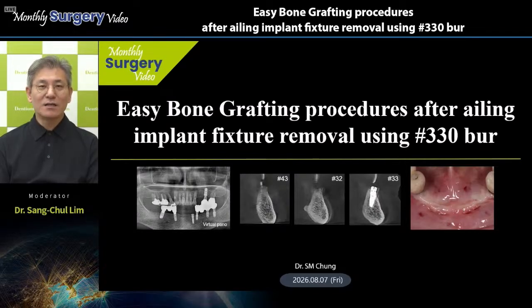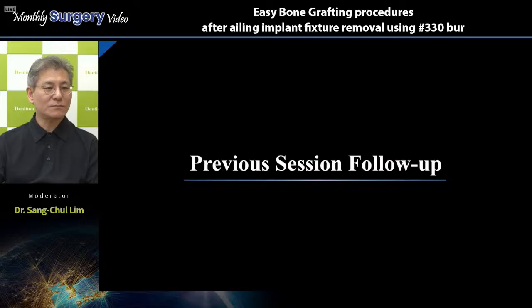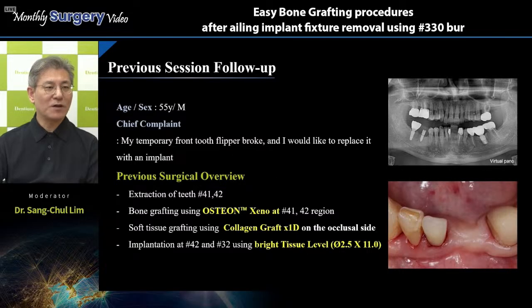Before starting today's surgery, let us take a closer look at the previous case. About the previous session, we did the anterior lower surgery.